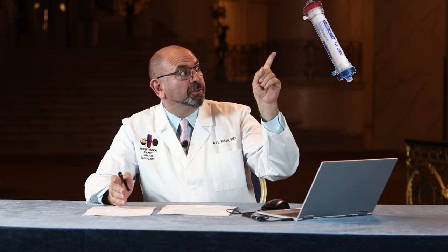It is totally different than what we have today, which is the hemofilter. If you look at this hemofilter, it is about a foot long and has a diameter of about 2 inches. And this is totally different than what we are going to be talking about.